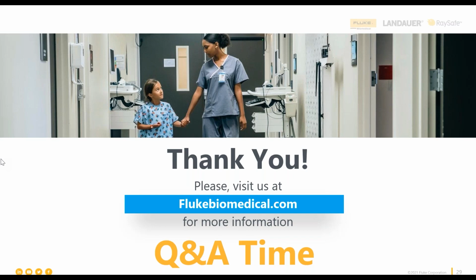If I'm understanding the question correctly, one way to interpret it is the cable itself. If you're moving the cable, it would only affect the reading if you have a loose connection or a broken cable, and I hope that's not the case. If you're talking about potentially coiling the wires, where the wires end up crossing each other, this can absolutely have an effect on your readings.